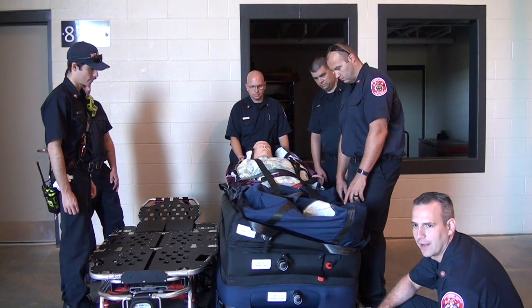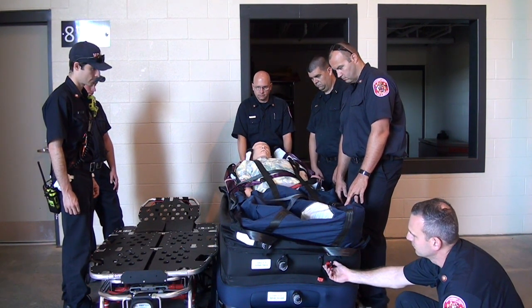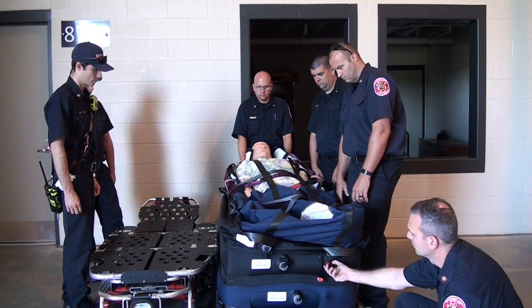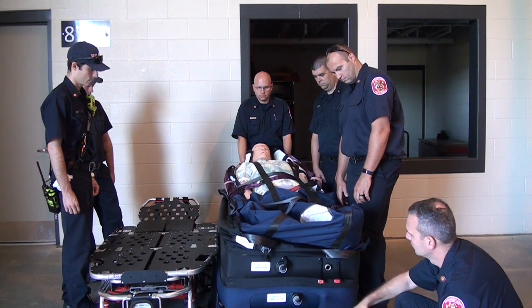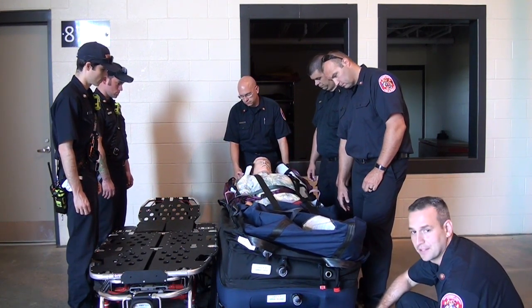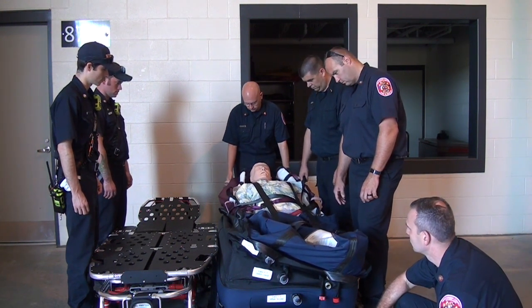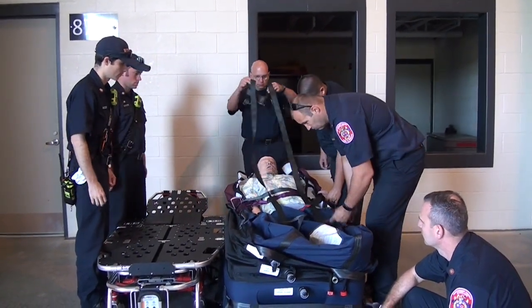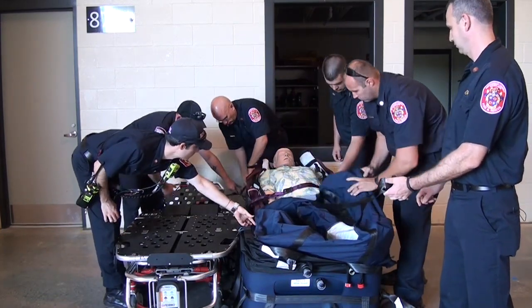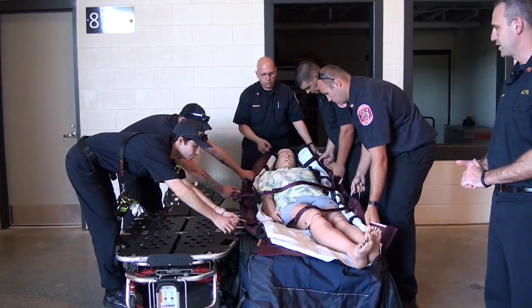You can see how it doesn't deflate evenly, which is why we have the providers on either side of the device. Once chamber four is completely deflated, we do the same thing for chamber three. We've left the pillow at the patient's head inflated so that we keep them in a slightly upright position and don't create any trouble breathing. We remove all the straps and we're ready to transfer our patient to the stretcher.